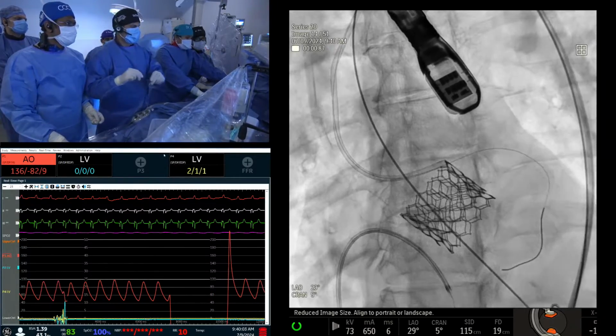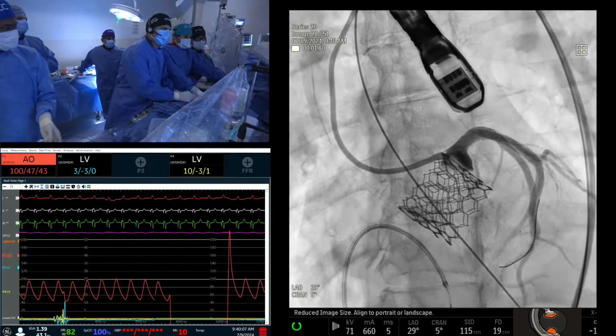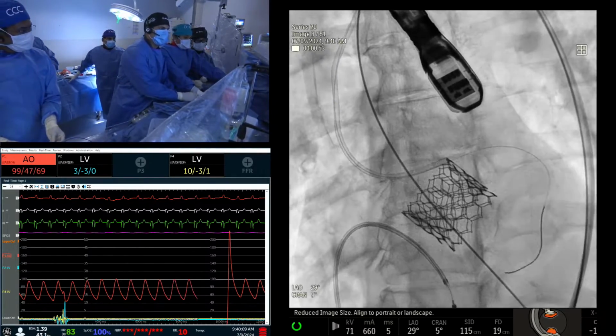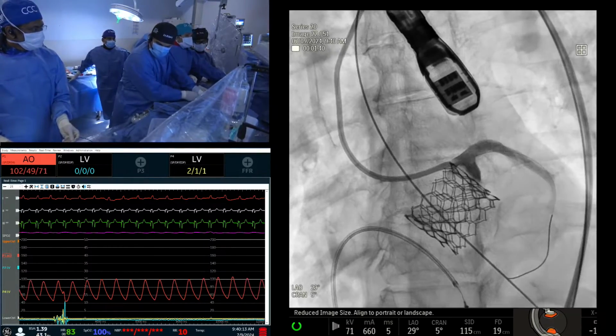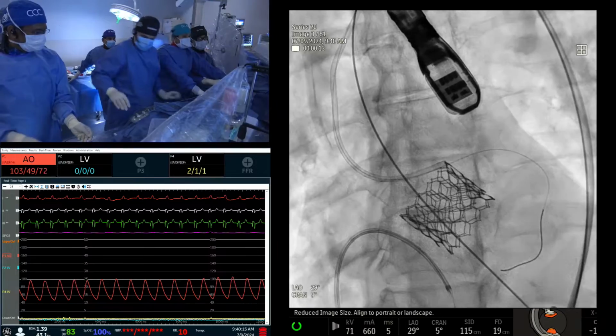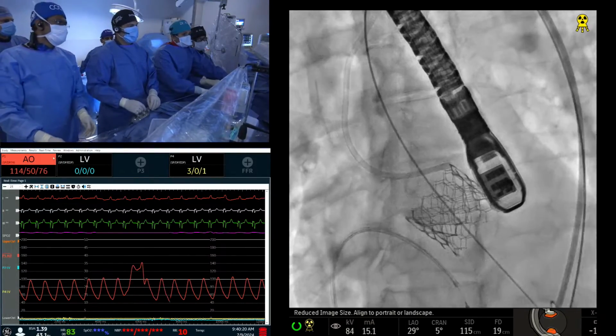We kept saying diamond, and how we are going to place the chimney if we need to, that we will leave it at the ostium of the diamond. Now there are double diamonds. So if you need to redo it, you have to go through the double diamond and then do the stent. See? Fluoro. So I'm coming out. We may be a few millimeters down. Take it out.